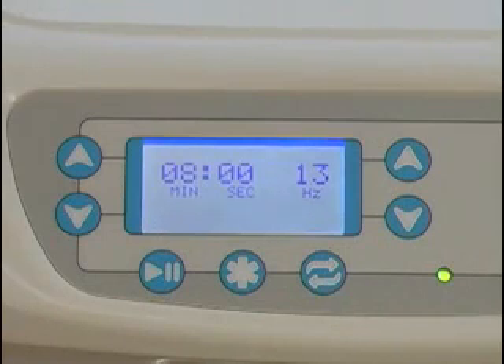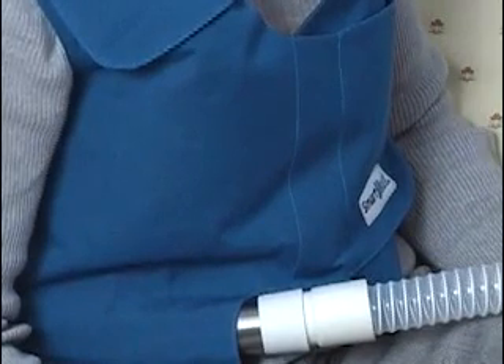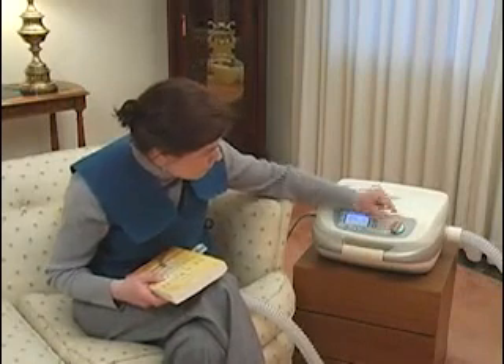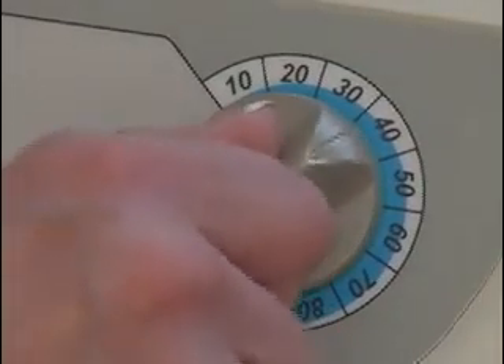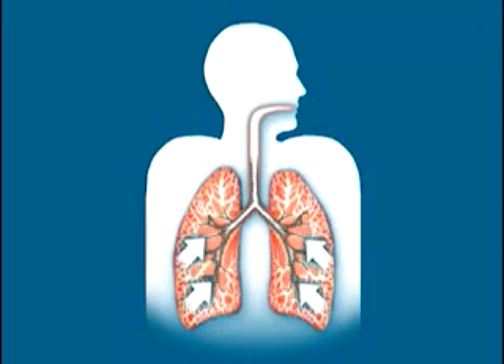Start at 30 and increase the setting to the highest level that is still comfortable. Once you have set the time and frequency to the settings your physician has prescribed, you can begin your treatment by pressing the Start button. As pulsing begins, you will feel a gradual increase in the hug from the vest. If you have not experienced HFCWO before, it may feel a little unusual at first, but it should not be uncomfortable. If necessary, the pressure adjustment control can be dialed down to reduce pressure for the first few minutes or the first few treatments. Then, after you are familiar with the feel of HFCWO, the pressure can be increased to the highest pressure that is still comfortable. As your vest fills, your voice will begin to sound chattery or like a helicopter. These sounds result from the cough-like pulses of air moving through your airways.